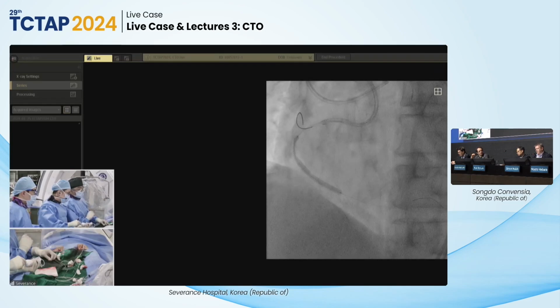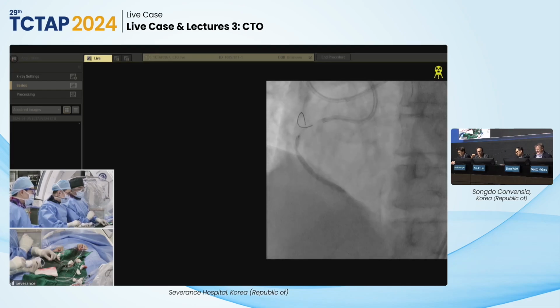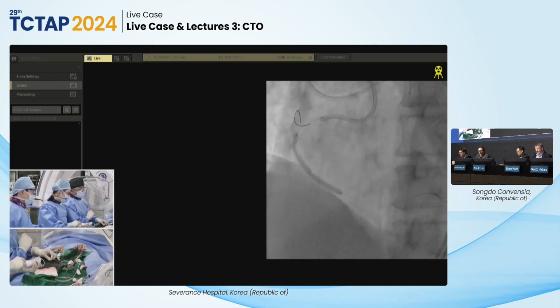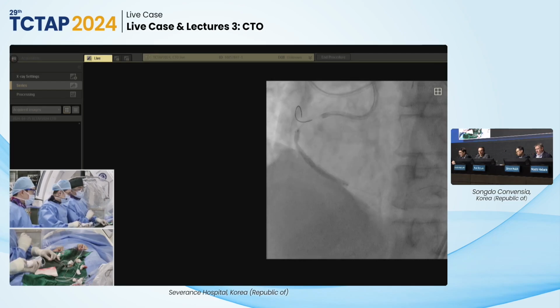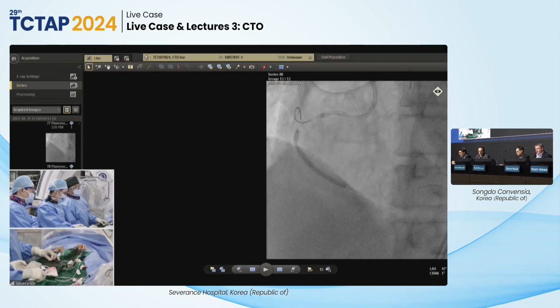We rarely see 3.0 arteries in our patient collective on the RCA, right? You see, that's basically something that you sometimes cannot see in IVUS, right? Here, you see that particular. But anyway, even if you see it, what can you do, right? If it's correct, it's correct. You can do post-dial. And there's no difference in pre-dial or post-dial here, right?